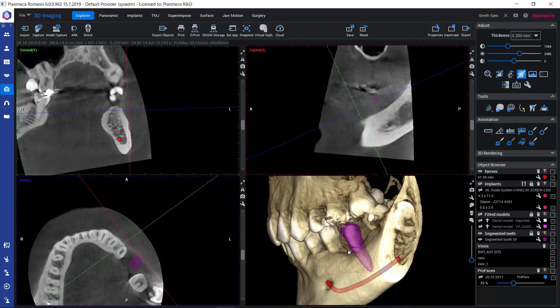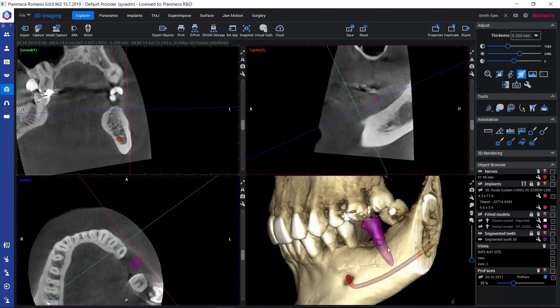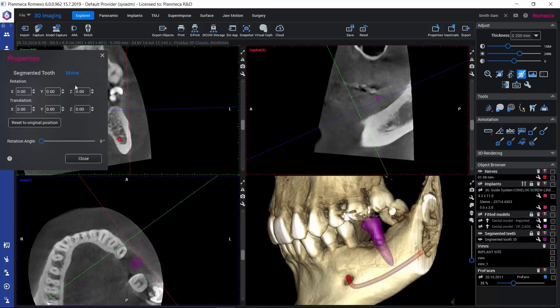With Ctrl and Shift down on the keyboard and using the right mouse button, we can also rotate the tooth. If we would like to reset the position of the tooth, we can open its properties from the object browser using the wrench icon. Here we can find the Move tab which has the controls for moving the tooth, and we can reset the tooth to its original position using the reset button.